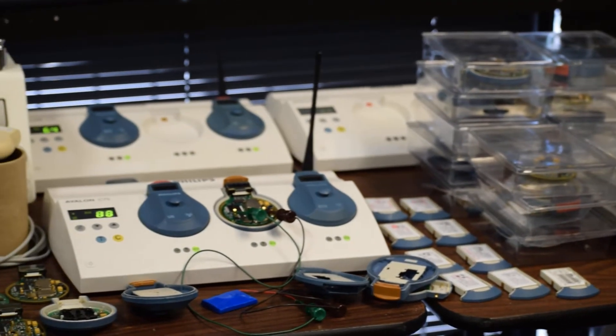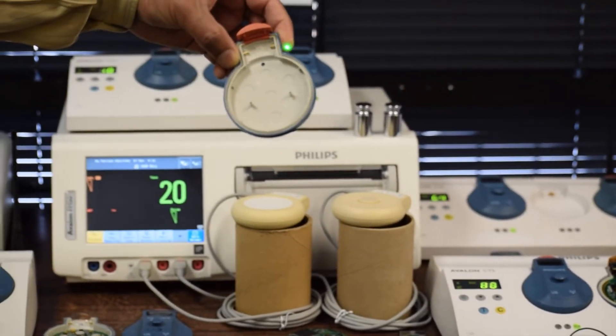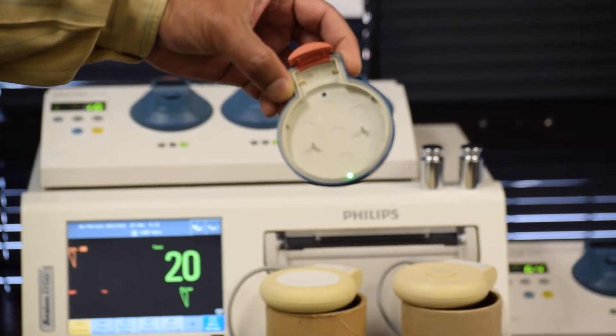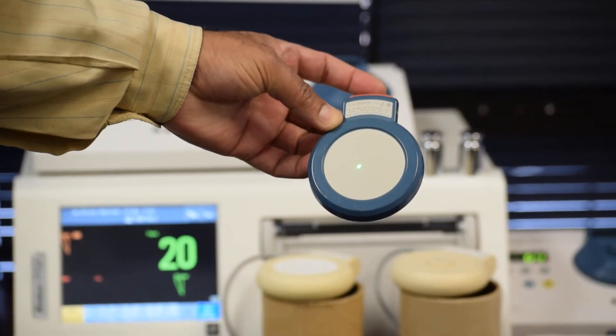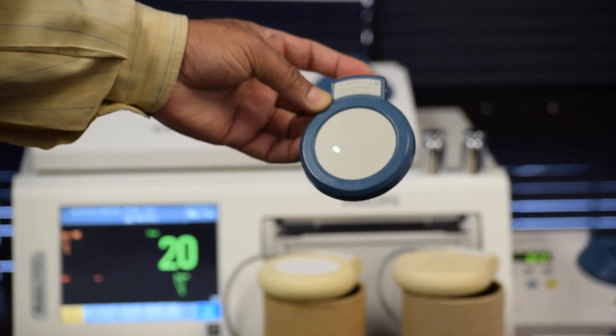Let us take a look at this transducer. See how clean it is when dismantled — there is absolutely no glue left, and there is no physical damage at all. The whole complete unit looks nice. Once it is assembled, you can't differentiate it from a brand new transducer.